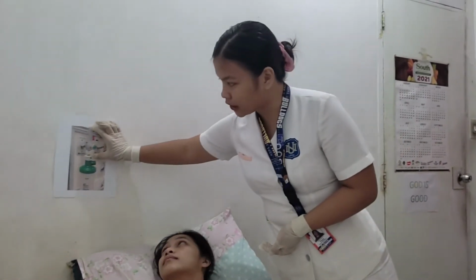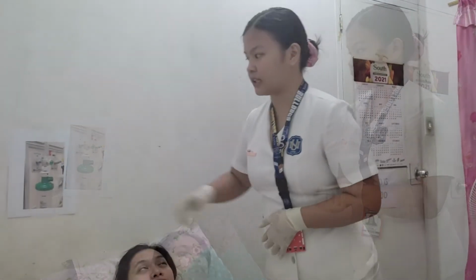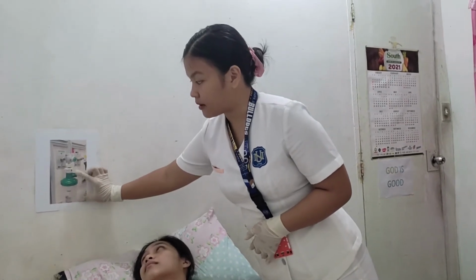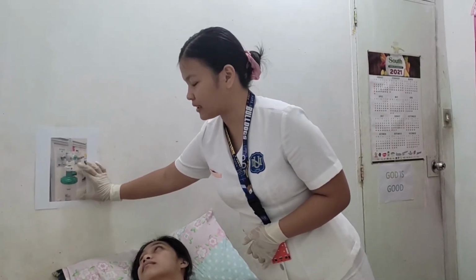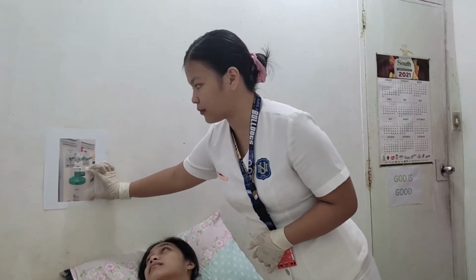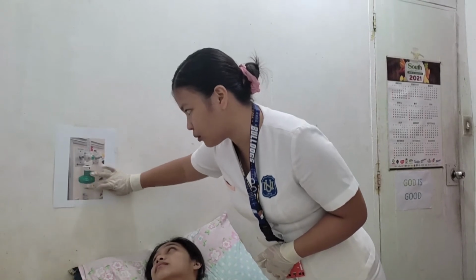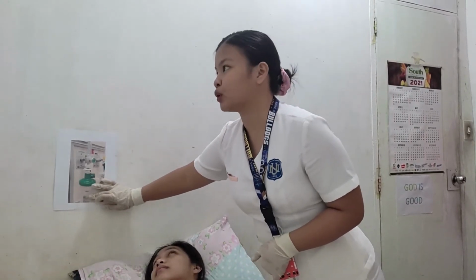For our next step, we will attach the flow meter. Since we do not have a physical flow meter, I just printed one out for us to visualize. This is the flow meter, and this regulates the flow rate. We attach the humidifier at the base of the flow meter, and we will fill it with water up here. This is the maximum. We can put in 100 ml.